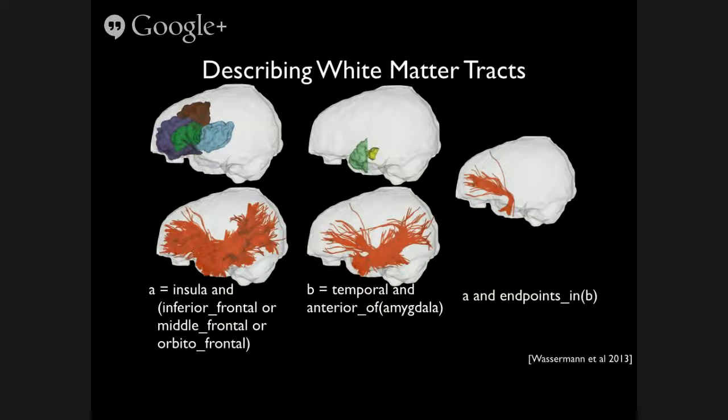Is the description of the planes in an analysis or some standards? There's no description of planes. But you do anterior, posterior, yes, but it's with respect to gyri and sulci. Okay. So everything is structure specific. We aimed specifically to not use image coordinates. The idea is to have descriptions that can actually be translated from an anatomy book and are independent of the coordinate space. We've had that request and we're thinking about adding it to the tool, because all of this is in a tool that you can download and use.